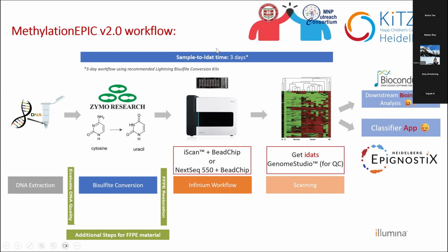Yes, of course, it can be done to shorten the time, but I believe that Felipe was referring to the ONT-based algorithm. So there is the Oxford Nanopore technology algorithm, which is a newer technology than Illumina. This whole workflow is talking about the Illumina workflow, which the consortium is currently implementing at partner sites. However, we have plans to implement the Oxford Nanopore technology as well at partner sites in the future. But we need to implement one technology at a time.